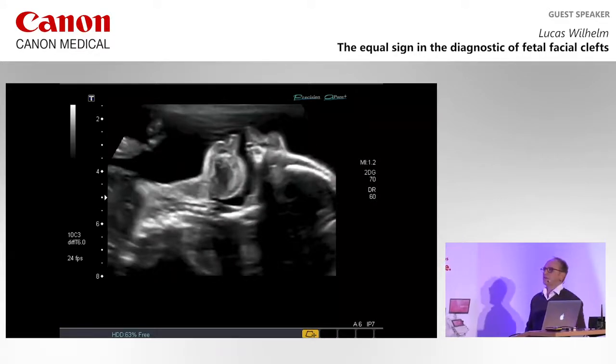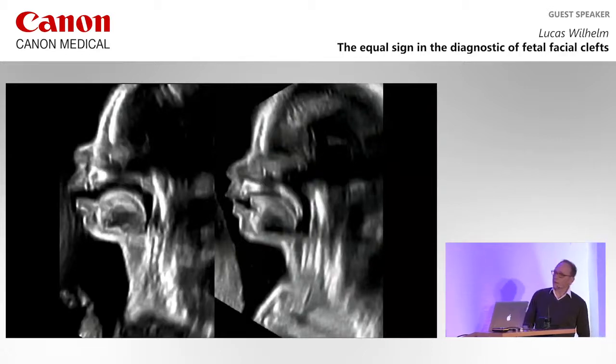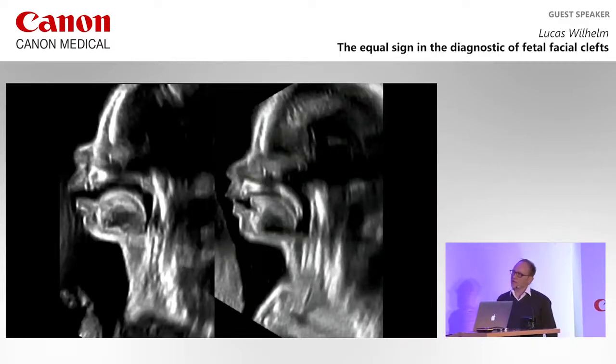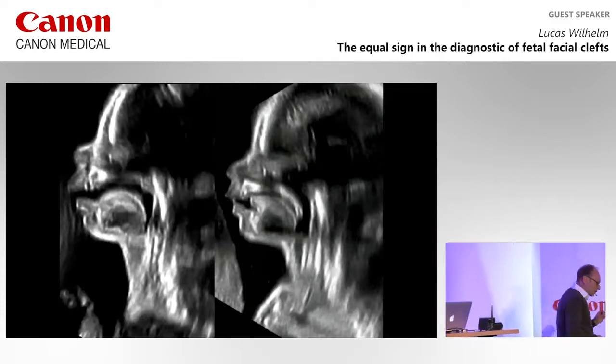And then you see this here. Okay? These are the normal conditions, and this is our child. And you can clearly see here the soft palate with the uvula, the tongue, and the wide open space of the pharynx. You see here the absence of the soft palate and of the hard palate. But what we see in this case is a normal position of the tongue.